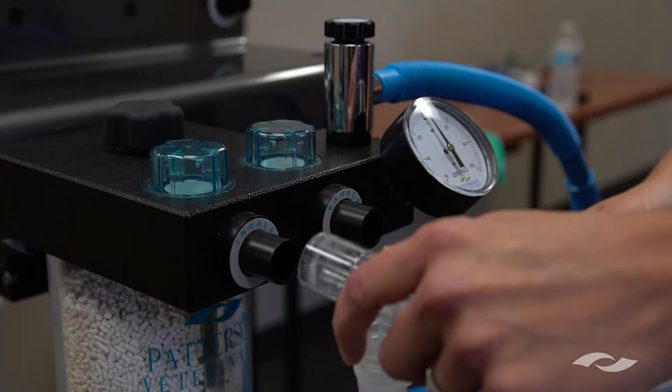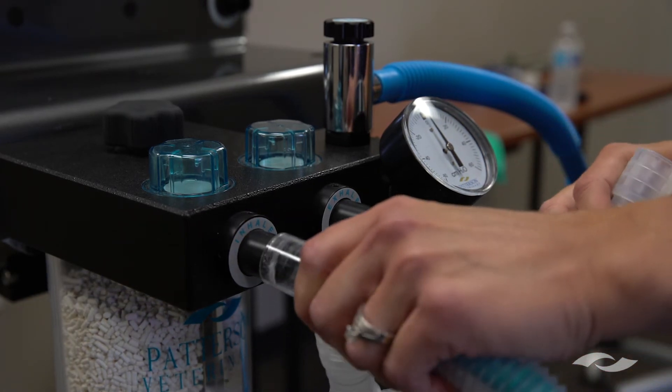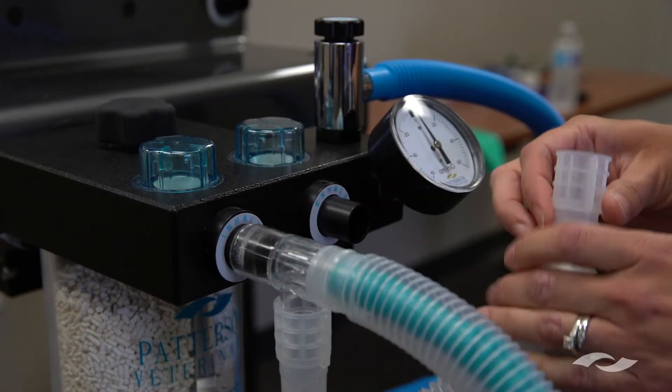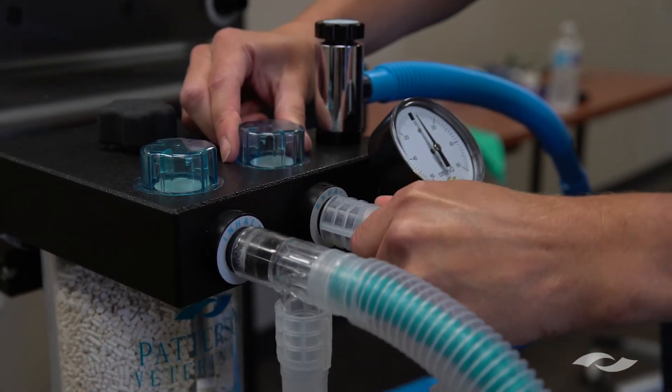For the third step we will attach the F circuit that came with the Versa 2 anesthesia machine. This portion goes to the inhale valve and this portion goes to the exhale valve.